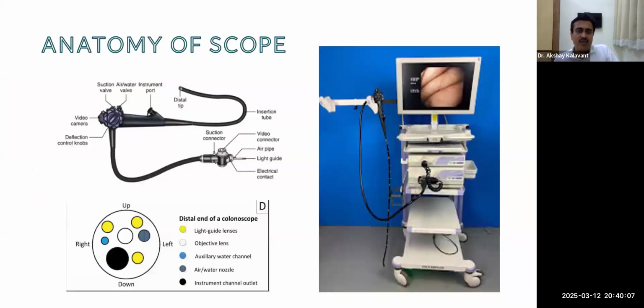Now, let's talk a little bit about orientation of the endoscope. We have all seen this as general surgery residents in the endoscopic suite. It is just to take you through a ride of how it looks, so that you get a little bit oriented. This is an endoscope which is totally flexible. We are talking about flexible endoscopy, and colonoscope and upper GI endoscope both look the same.